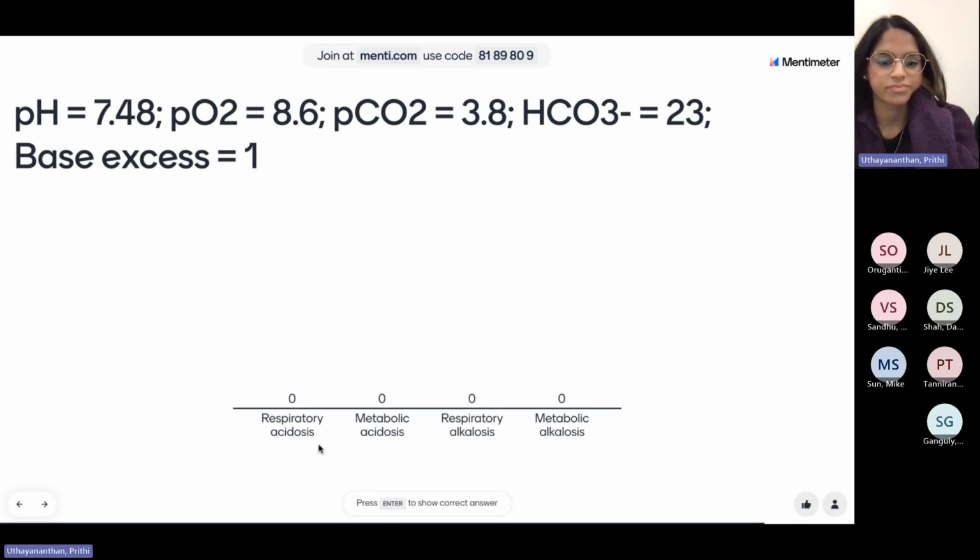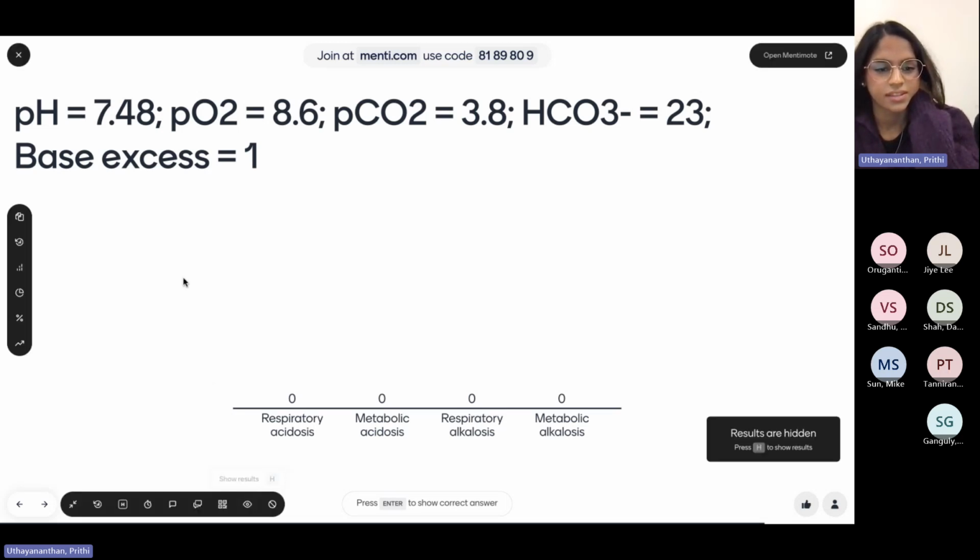Okay, so yeah. Now you've got a normal chest X-ray, and you've got your ECG, which is just sinus tachy, and then now your blood gases come back. So I haven't got the normal values on here, so I'll just tell you. pH is high. O2. Oh, they're there. Okay, that's fine.